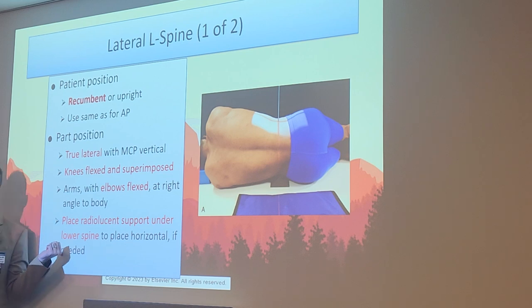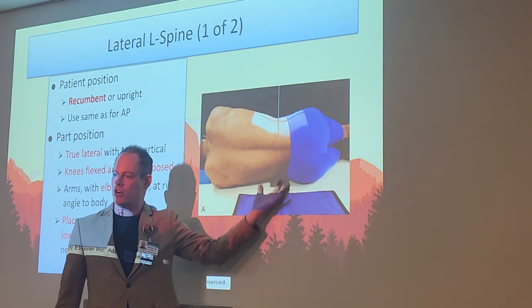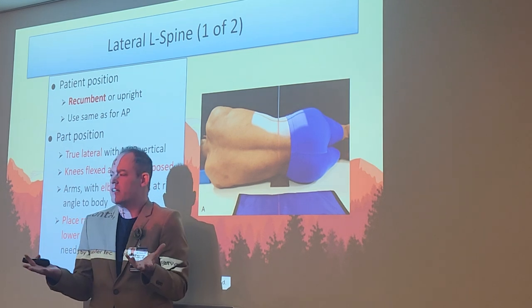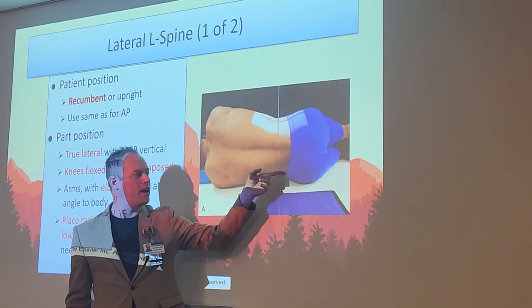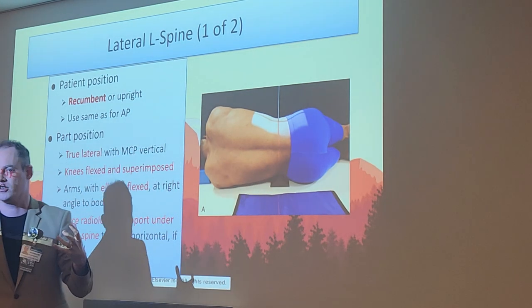And also, if you have it available, there's a very great way to optimize your lateral L spines. You probably don't see many people do this, because naturally, if you look at the picture, if we're just lying on the table, the side of the body dips down. It's actually going to curve the spine. It's not going to put it in that nice straight line that we want to see. So there'll be a little bit of curvature. Usually it's still a pretty acceptable image, but if you want to once again optimize that image, place that sponge under their waist, right above the crest. That's going to put that spine in a nice straight line like you see in this picture right here, giving you a really beautiful lateral L spine.